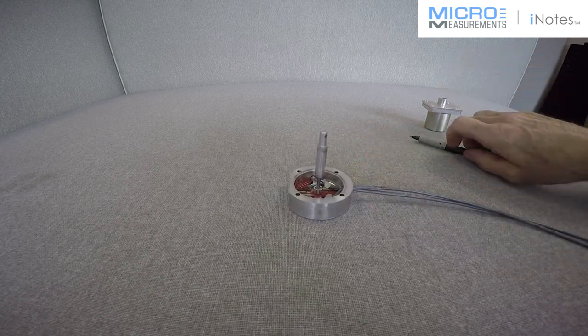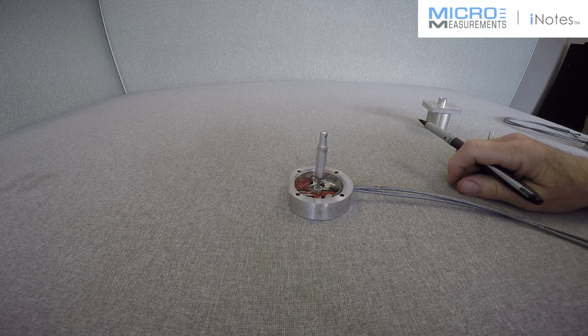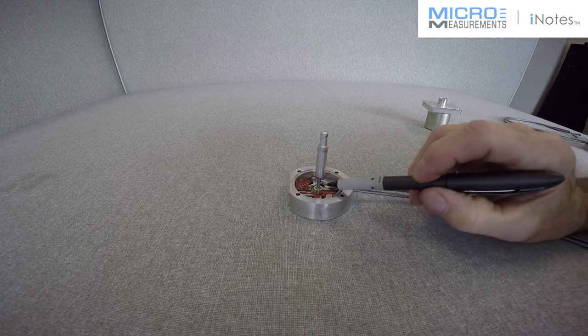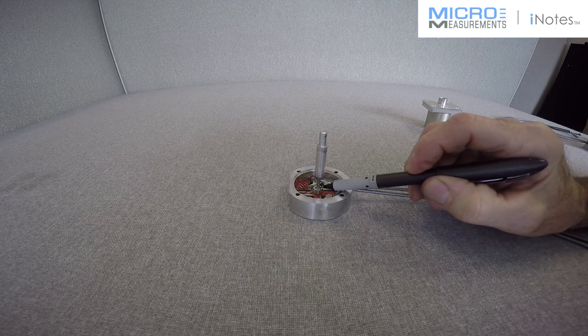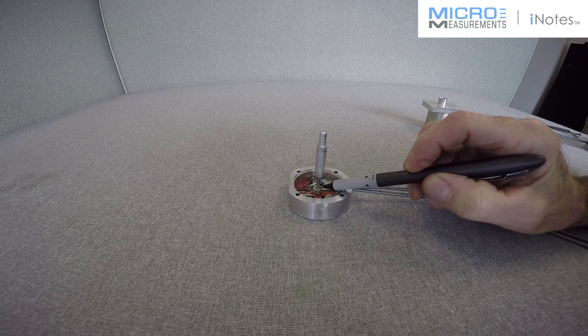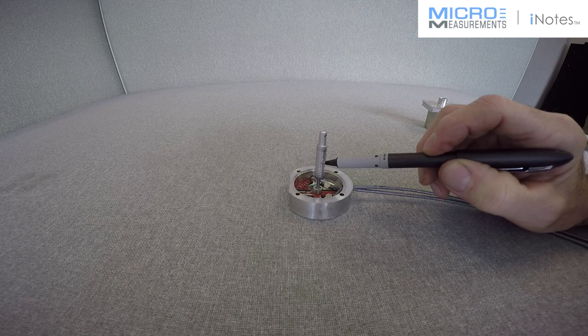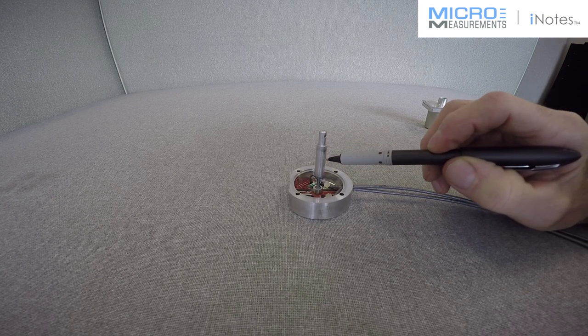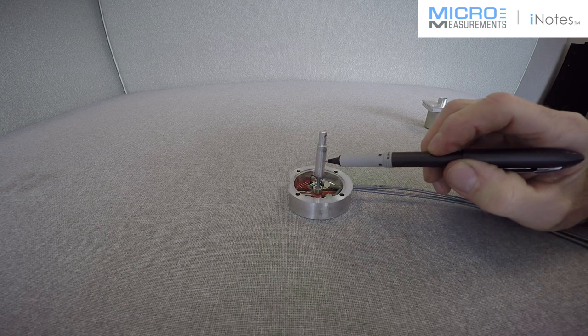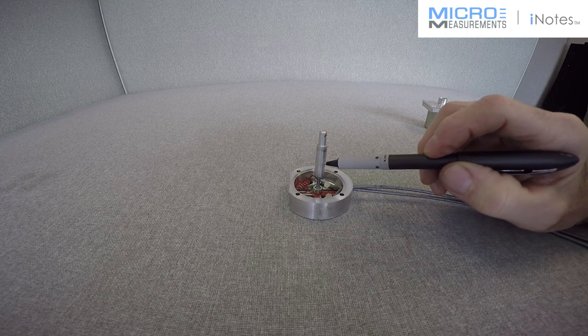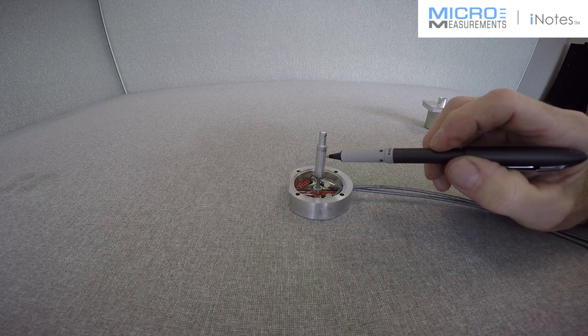To get increased deflection so an overload stop would be functional, we introduced a spring steel wire bonded into the housing here, the bottom section, which went up inside the actuator arm. So we had about a one inch length of spring wire to give us proper deflection.